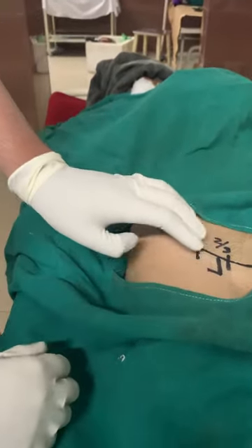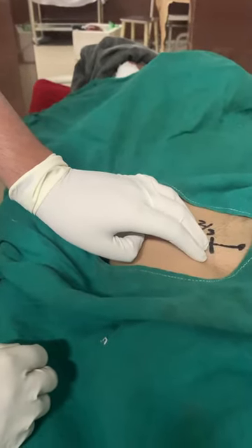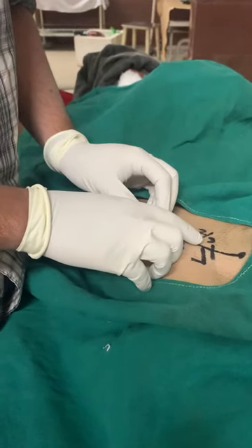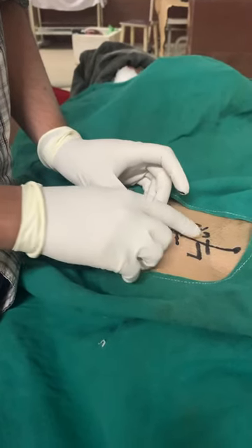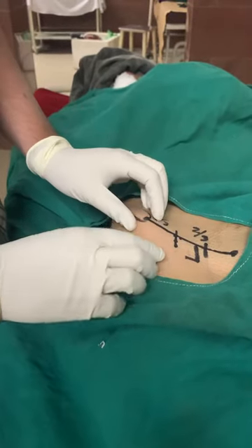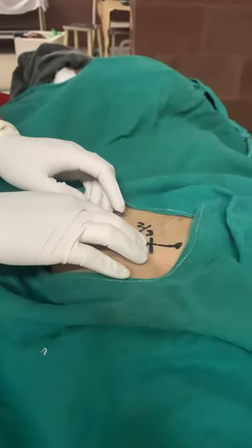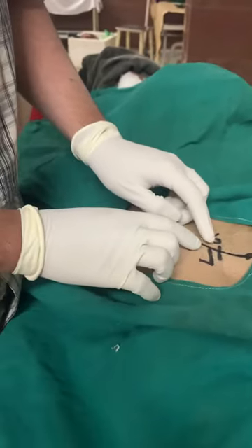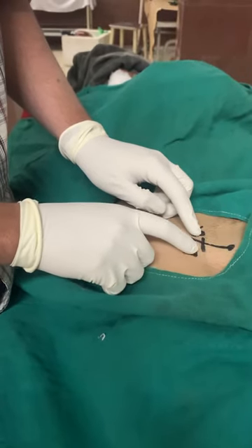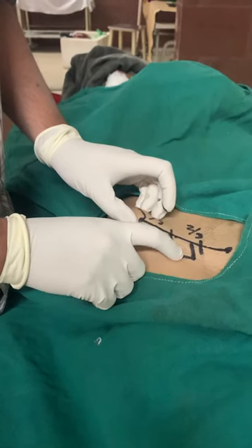Then we will palpate the femoral pulse here. Here is the femoral pulse. We will draw a line two centimeters below the inguinal ligament and one centimeter lateral for the femoral nerve block by loss of resistance technique. This line here corresponds to the femoral pulse. From the inguinal ligament, we will draw a line two centimeters below and one centimeter lateral. This is the point where we will do the femoral nerve block.